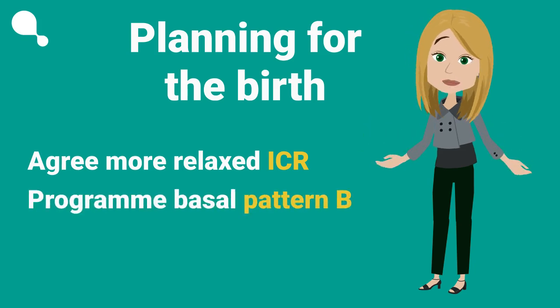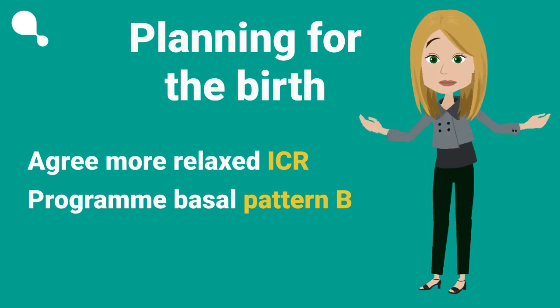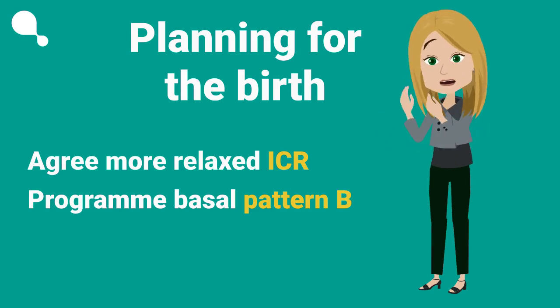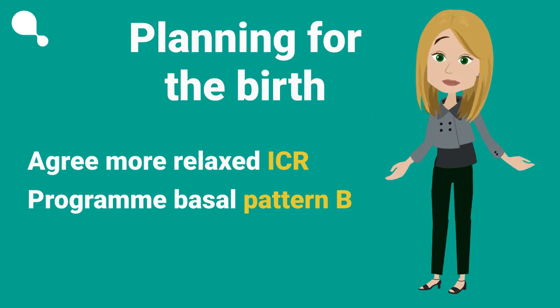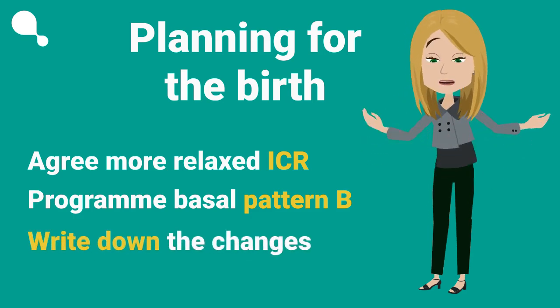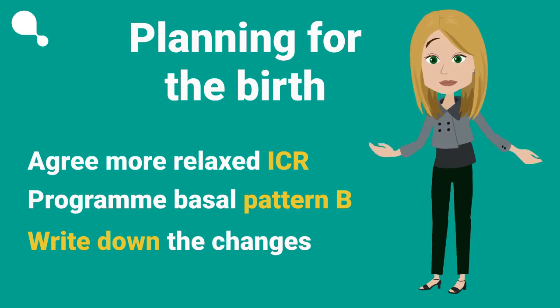Program a reduced pump basal pattern B on the pump. Pattern A's basal rate would have been increased throughout the pregnancy as a safety net in case CamAPS FX couldn't work. Only swap to pattern B on the pump when the baby is born. All these changes should be written down in your medical notes, and you should also have a copy.